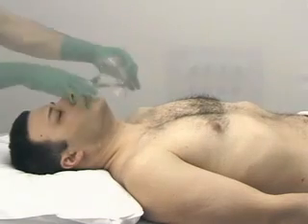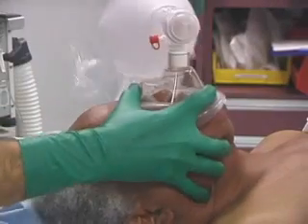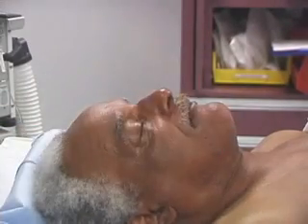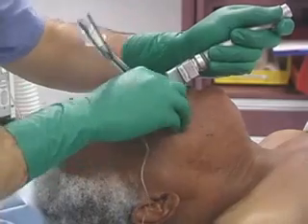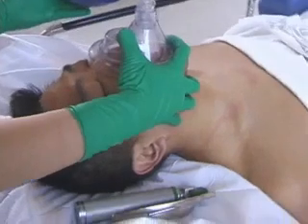Discontinuation of face mask ventilation depends on clinical circumstances. Patients may require a more definitive airway management, such as endotracheal intubation. On other occasions, all that is needed for patients to recover completely is effective face mask ventilation with oxygen. Every physician should be familiar with this potentially life-saving technique.